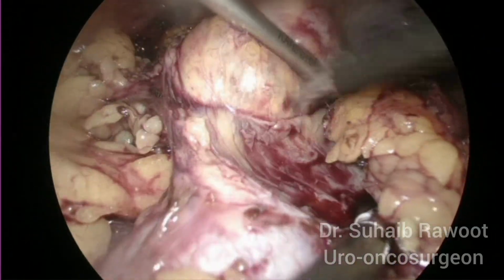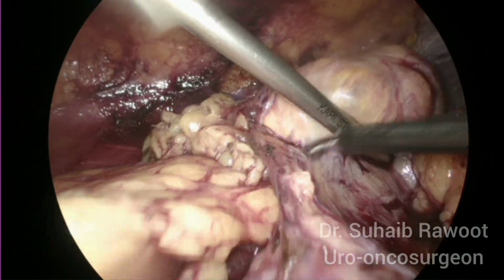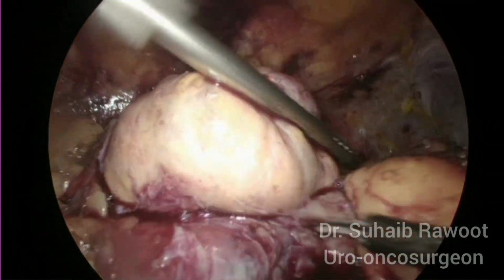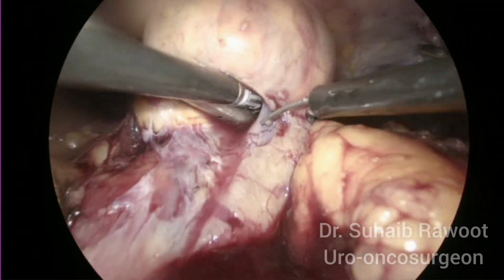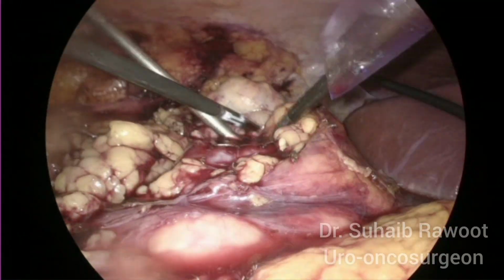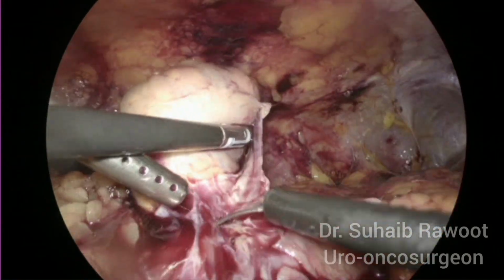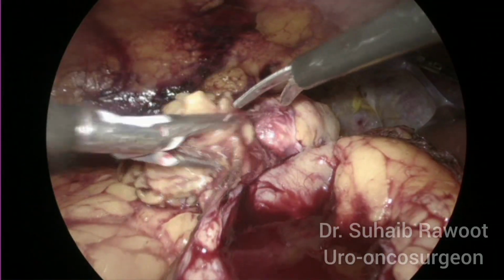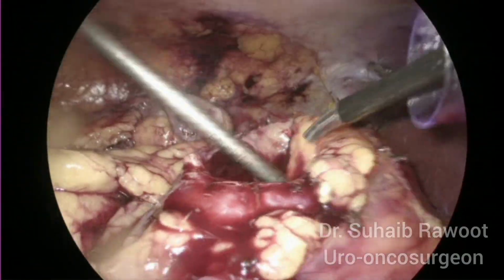Tumor capsule is completely intact and we have reached the lateral border of the kidney. Tumor resection is now completed.